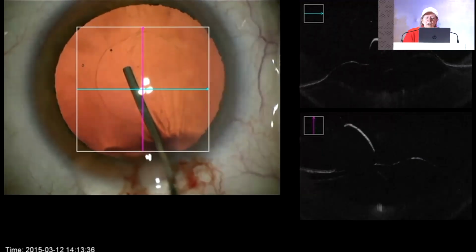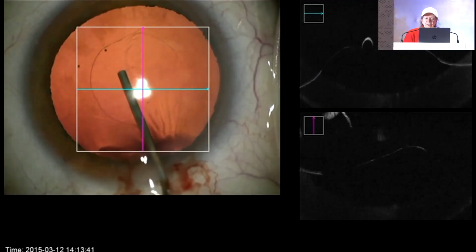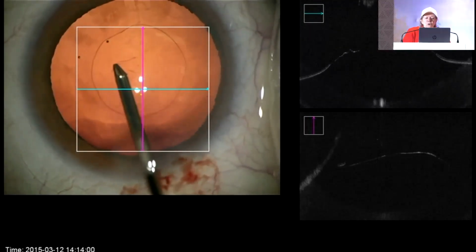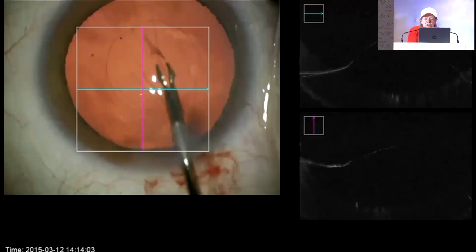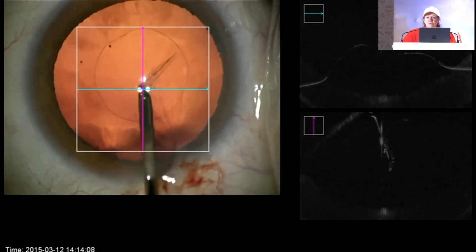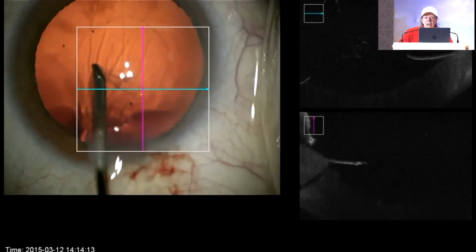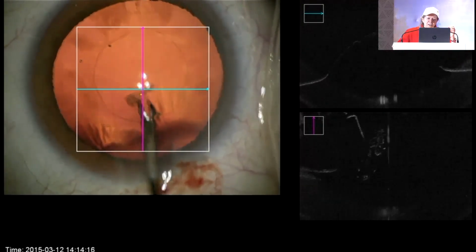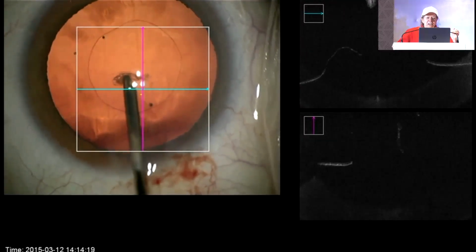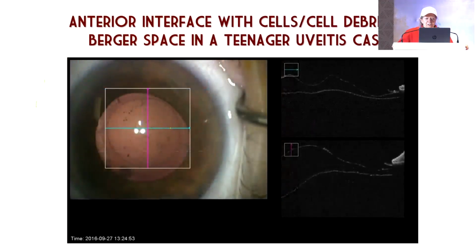That's the reason why in all cases it is much better to inject viscoelastic material through the opening in order to protect, to push back the anterior hyaloid, and then you can perform your posterior capsulorhexis in a very, very safe way, and you have not to fear to damage your anterior hyaloid at all. Never listen to the people who say that you can do your posterior capsulorhexis straight away, always separate it.